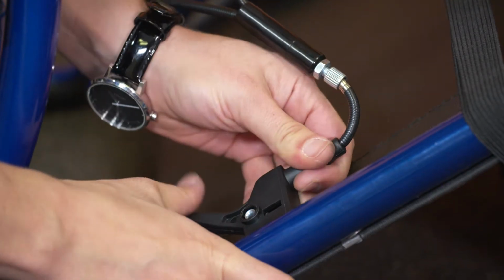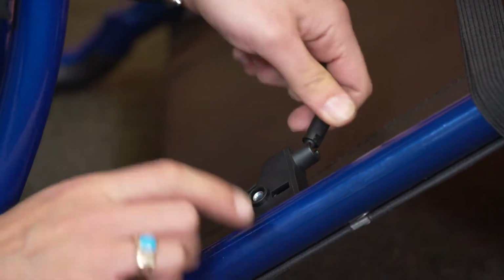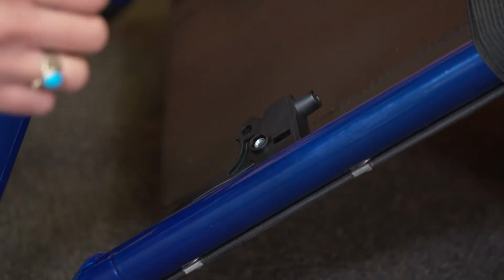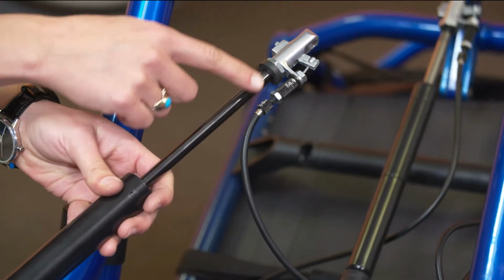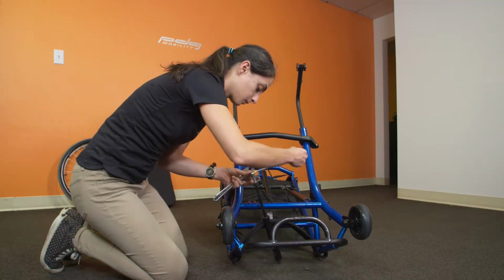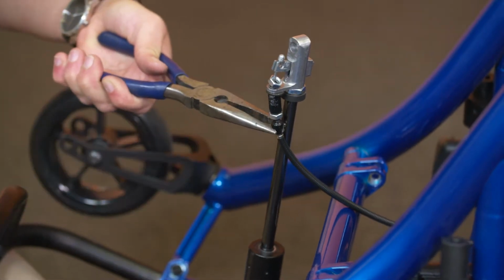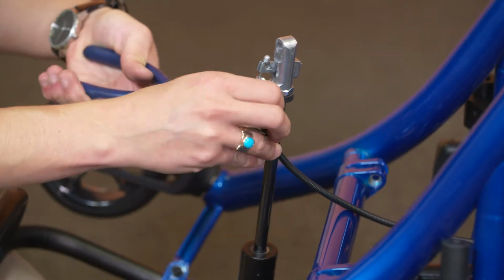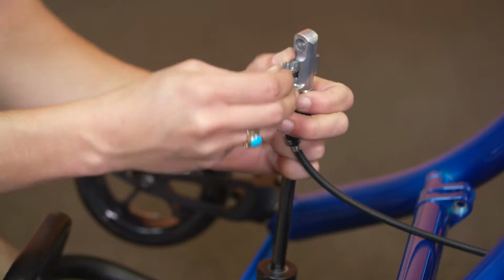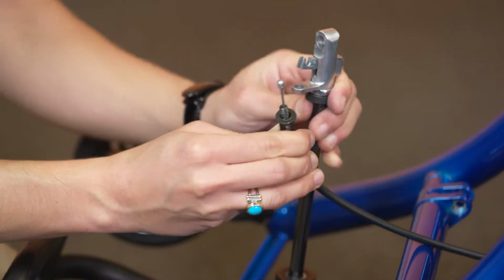Start with pulling the cable from the activating trigger end. Followed by removing the cable from the strut activator end fitting by loosening the fasteners. Now the gas strut assembly has been completely removed from the chair.